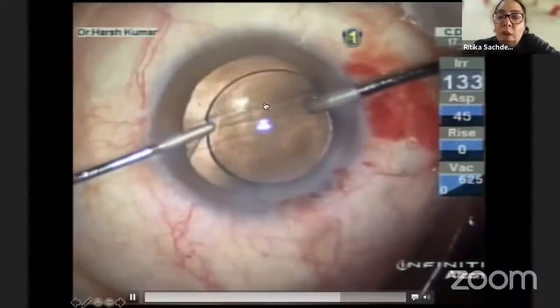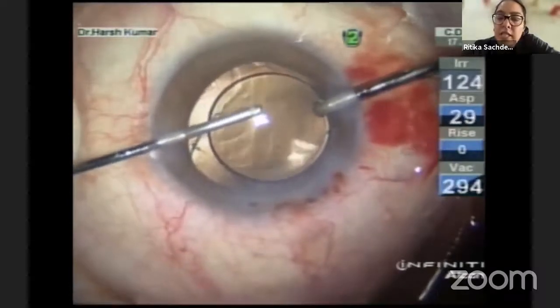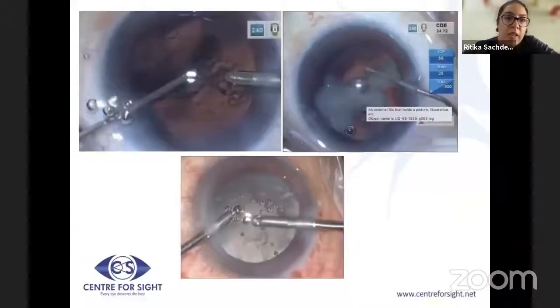PCR. This IOL will center well if there is no vitreous, but if there is vitreous, you will not see it center as well. And that is again a sign for you to go back and check on complete vitreous removal. So take home messages from this video. First, if you have a PCR, notice it, don't move out of the AC.